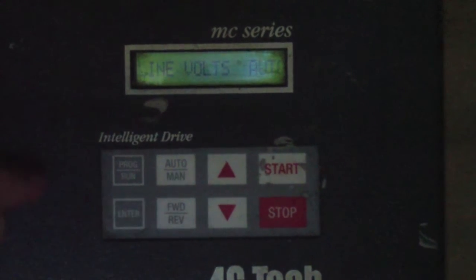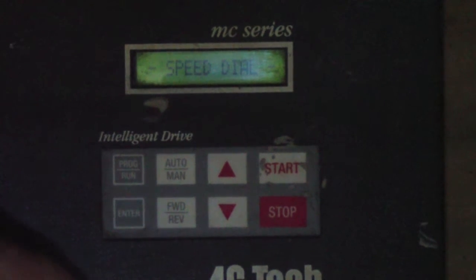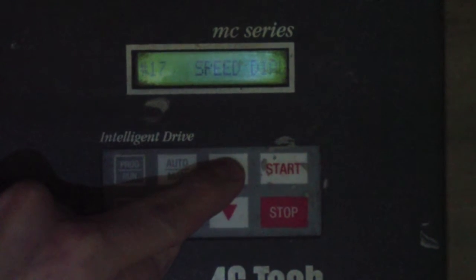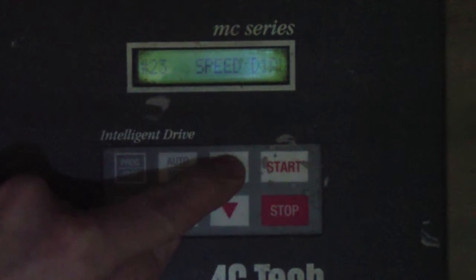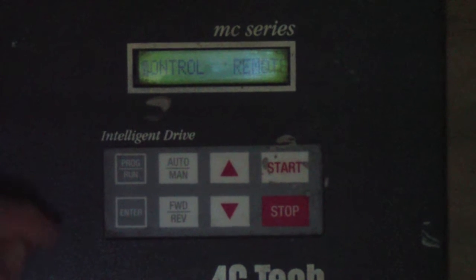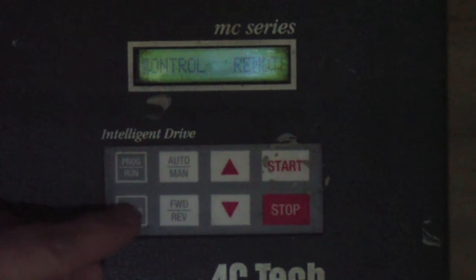Then hit the Enter key. The display will read Line Volts Auto; go ahead and hit the Auto Man button. Use the up arrow to go to parameter number 30. If you pass parameter number 30, just use the down arrow to come back down to 30. It says Control — go ahead and hit Enter. Currently it's showing Control is set to the Remote setting. Hit Enter again.